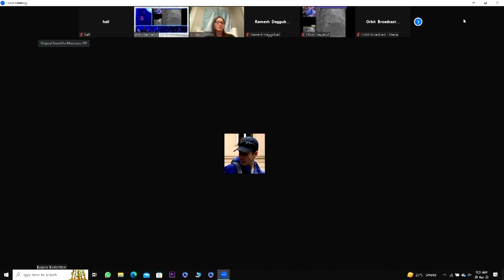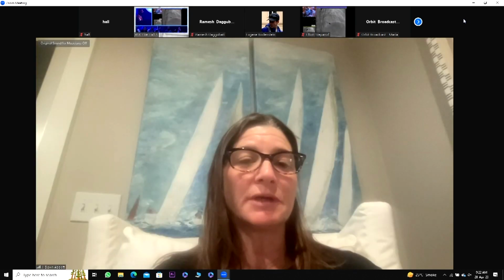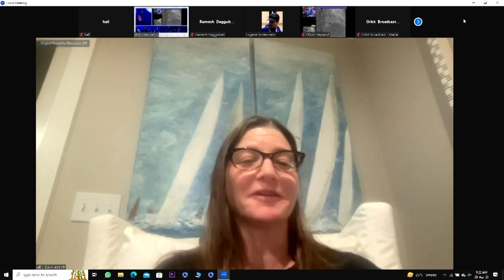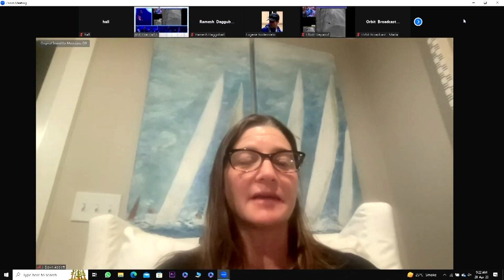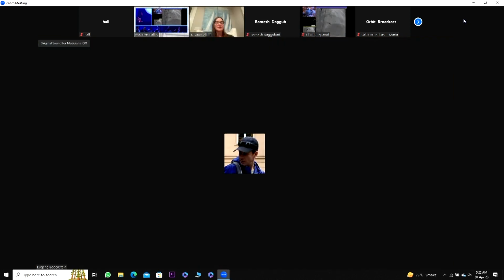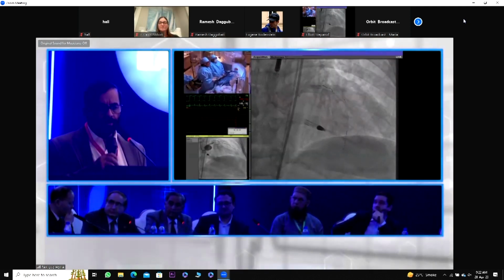You don't really need to take pictures in between the initial placement of the stent and the final kiss. Especially if you've used IVUS and you know the length of your main vessel stent and the length of your side branch stent, you don't really need much dye. There are some case reports, and in the interest of the audience, tomorrow we'll be having case presentations with zero contrast.